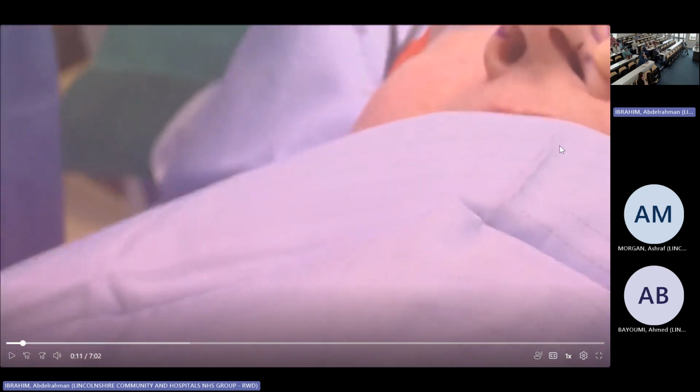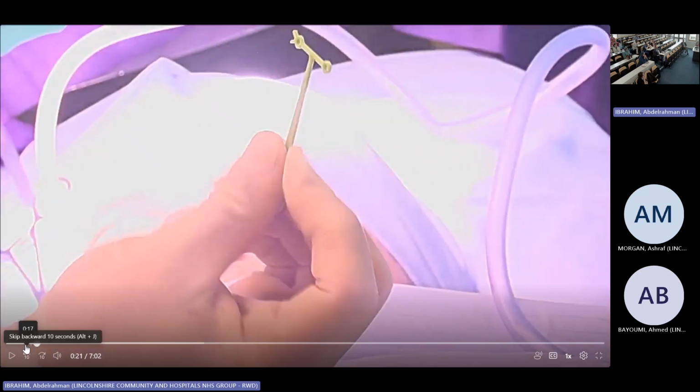So simply what we do is, because I'm going to forward it very fast as well, we mark the areas that we need to put the implants in, and usually we measure the height of the nose, so from the ala to the tip, and its midpoint. So this is the area that we can put the implants. Laterally, what we do is we come that way.